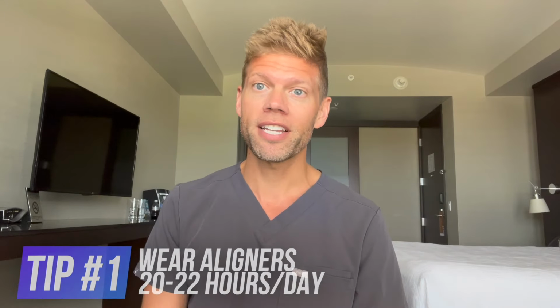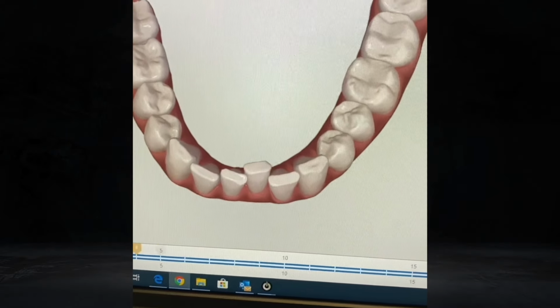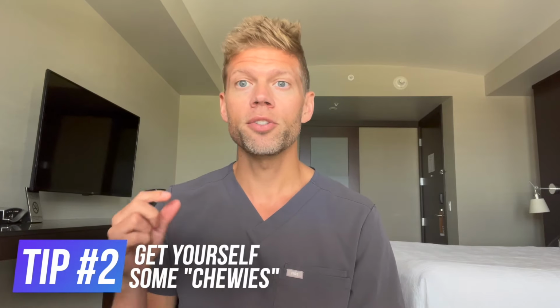So the first tip is you have to wear your aligners at least 20 to 22 hours a day. If you don't wear it, it won't work. In fact, if there's certain times where you're not wearing your aligners, your teeth actually might regress and go back to their original positions.